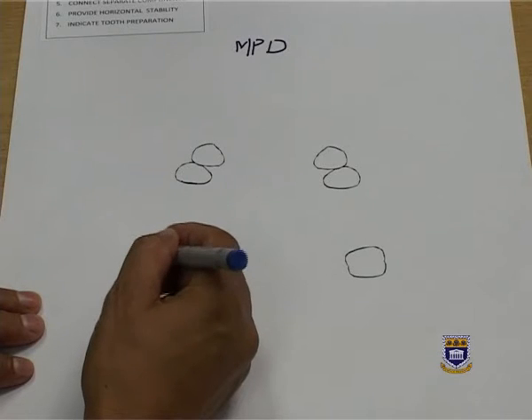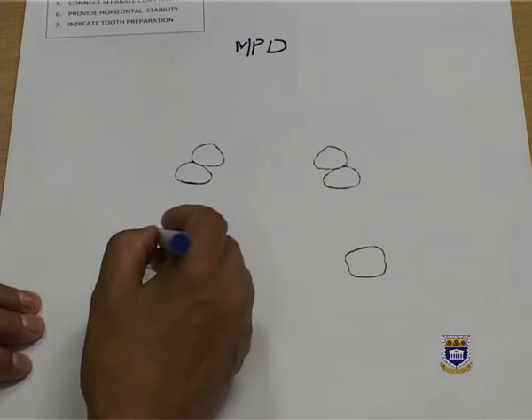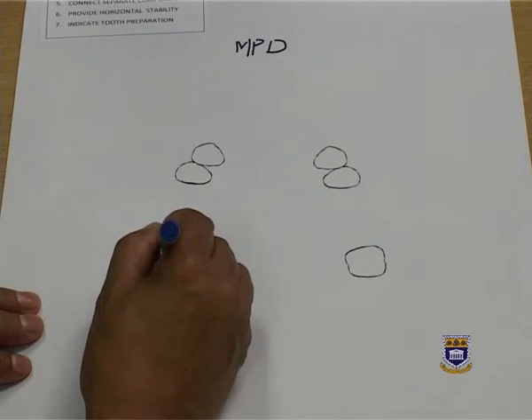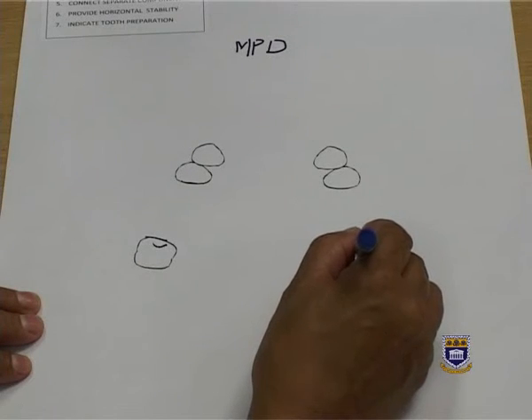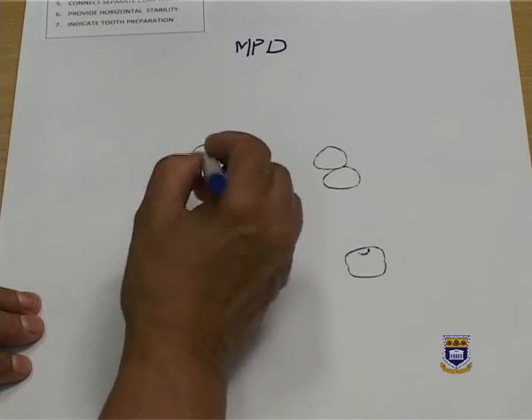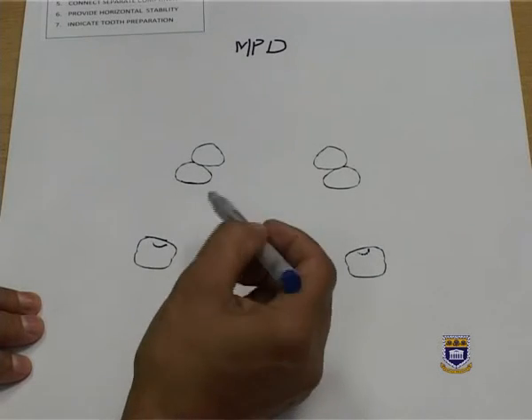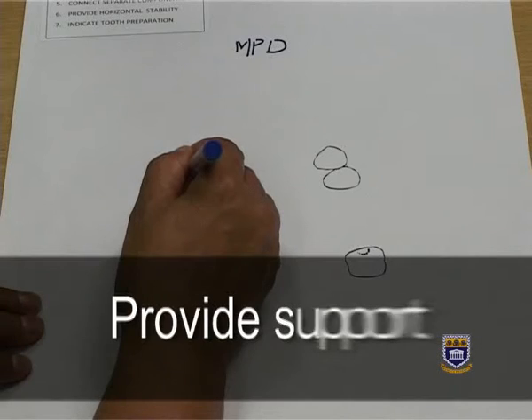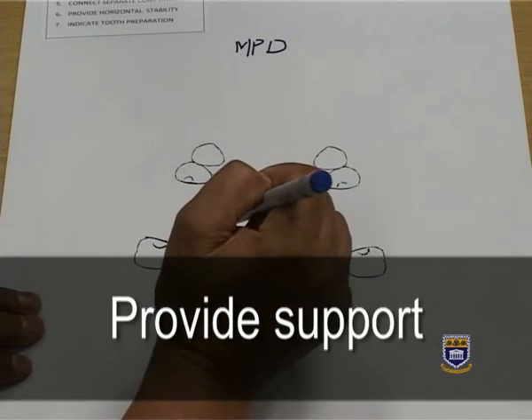Support has to do with provision of rests, and all dentures must have 3 rests. In this case, I will have my mesial rest on my 1-7 and another mesial rest on my 2-7. I've got 2 premolars as abutments, and because there are 2 teeth missing on all the saddles, 2 teeth and more, I need to provide support on all my abutment surfaces.